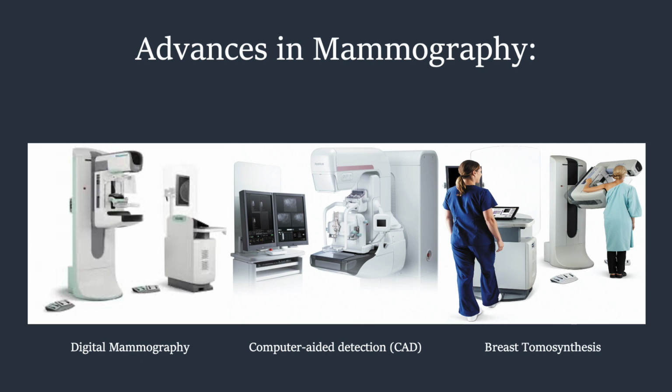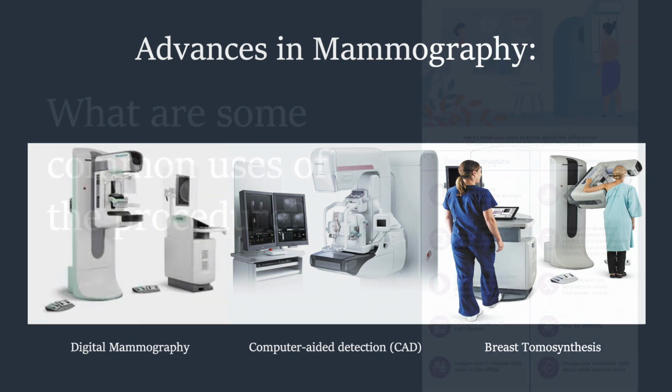And breast tomosynthesis, also called three-dimensional mammography and digital breast tomosynthesis (DBT), is an advanced form of breast imaging where multiple images of the breast from different angles are captured and reconstructed into a 3D image set. Large population studies have shown that screening with breast tomosynthesis results in improved breast cancer detection rates and fewer callbacks, instances where women are called back from screening for additional testing because of a potentially abnormal finding.